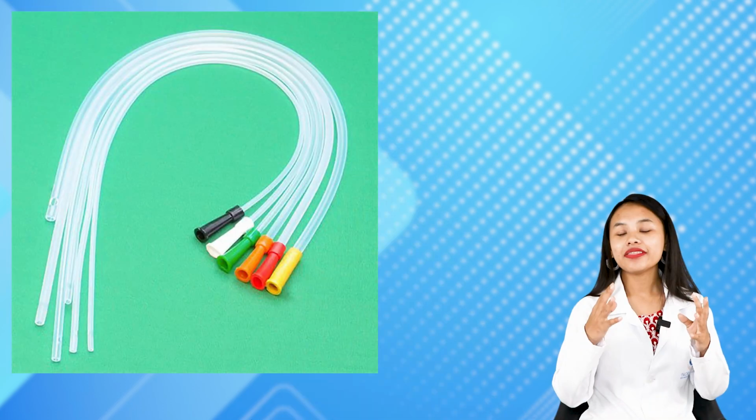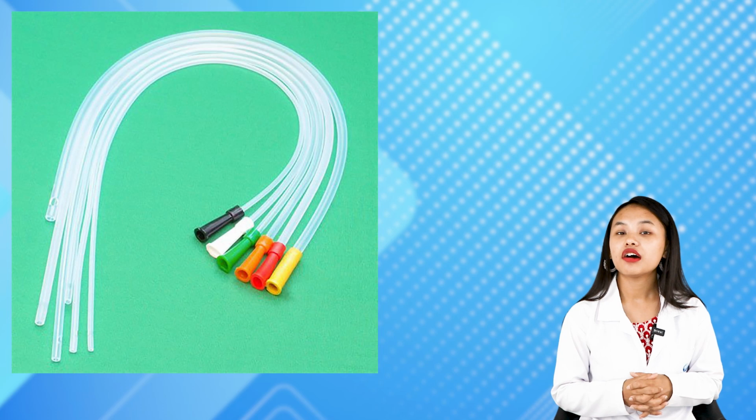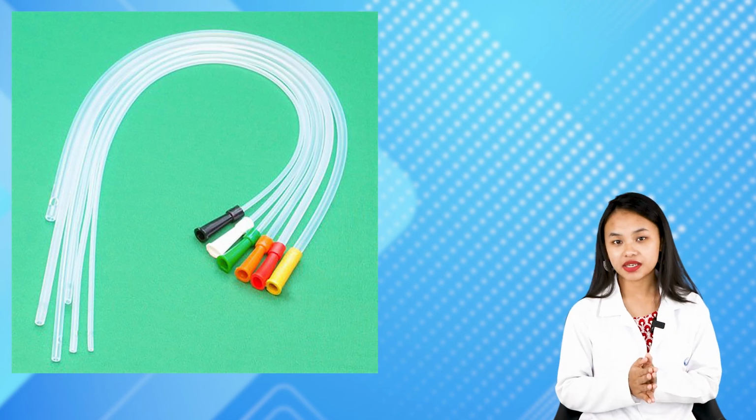Enema administration involves instilling a solution or fluid into the rectum, colon, and large intestine. And this can only be done by using a flexible plastic tube with several large holes at the tip.